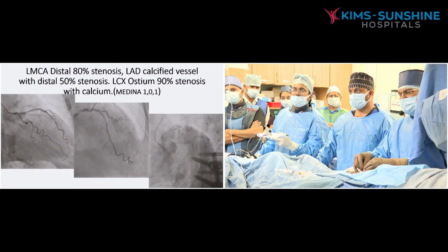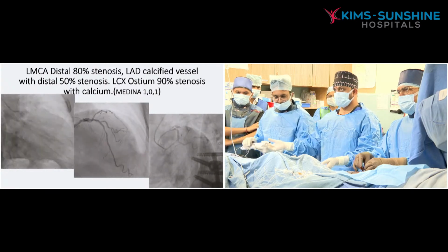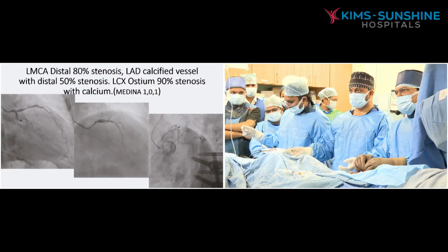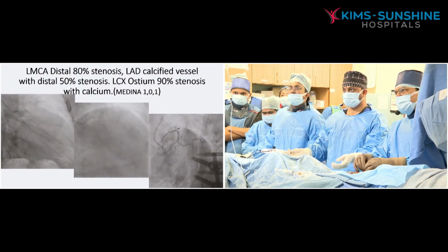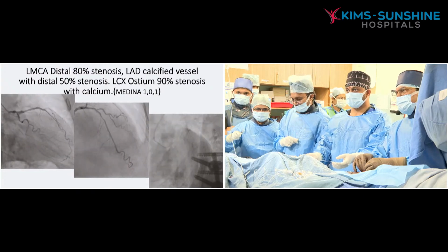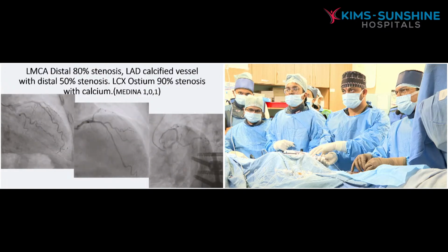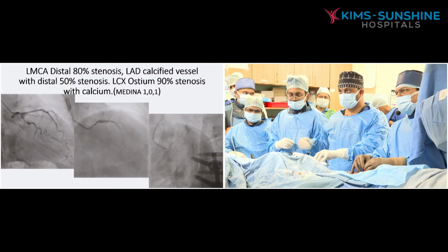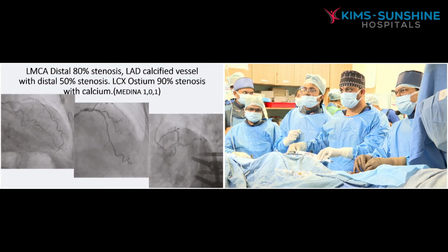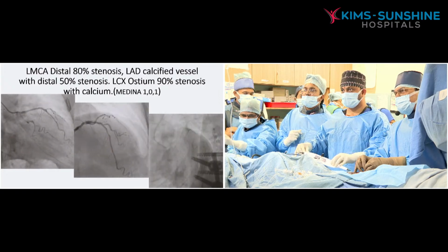Ready? Tap, sir. Keep the burr straight. Come nearer. Yeah, that's it. Come nearer. Come nearer. Catheter is sitting nicely. We can advance. Pull the wire slightly. That's enough. It is sitting nicely. No need. Come now. Come nearer. Pull the wire slightly. It got disengaged. Slightly pull. Come nearer. Pull the wire slightly. Come nearer.